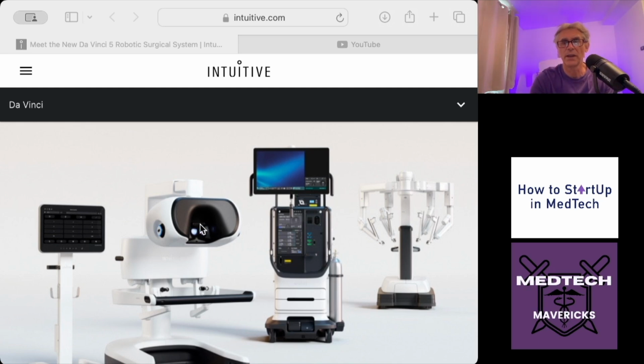But basically, with their Tile Pro that's in here, I can bring in preoperative images, CAT scans, MRIs. I can bring in 3D images and sort of have them in a separate screen there. I get really good control of everything, including the electrosurgery and the insufflation, from right inside here. And it feels a little bit haptic-y when you're doing that. I liked it.